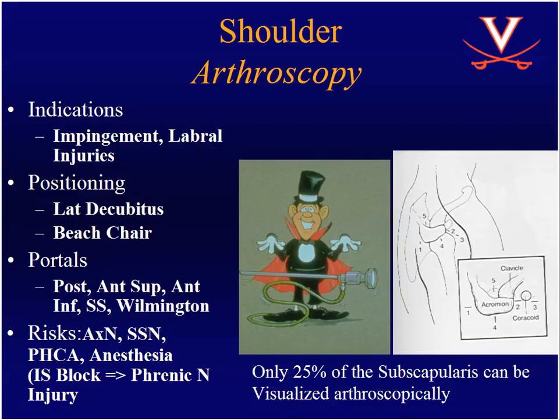Shoulder arthroscopy has come a long way from just 10 years ago. It allows us to not only make a diagnosis, but to treat shoulder problems that we weren't able to just a decade previously. There are two different ways to position the patient, lateral decubitus and beach chair. Both are equally efficacious. The only potential question here is that lateral decubitus can sometimes be associated with neuropraxias from the traction that's used. The portals, of course, are very well described.